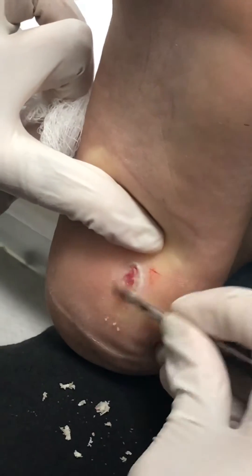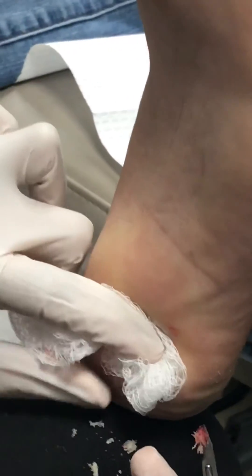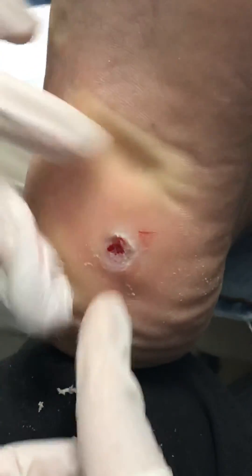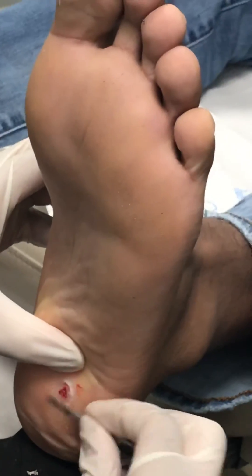It has little blood vessels in it. Something interesting — I'm going to let go and you're going to see the little blood vessels. Come closer. So that's a wart. And that's it.